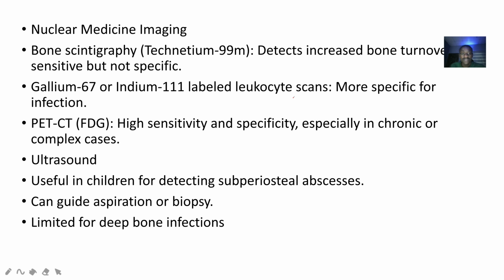We also have nuclear medicine imaging, where you can do bone scintigraphy. That's technetium-99m. It will detect whether there's increased bone turnover. You have gallium-67, you have indium-111, all of that. PET scan combined with CT scan.